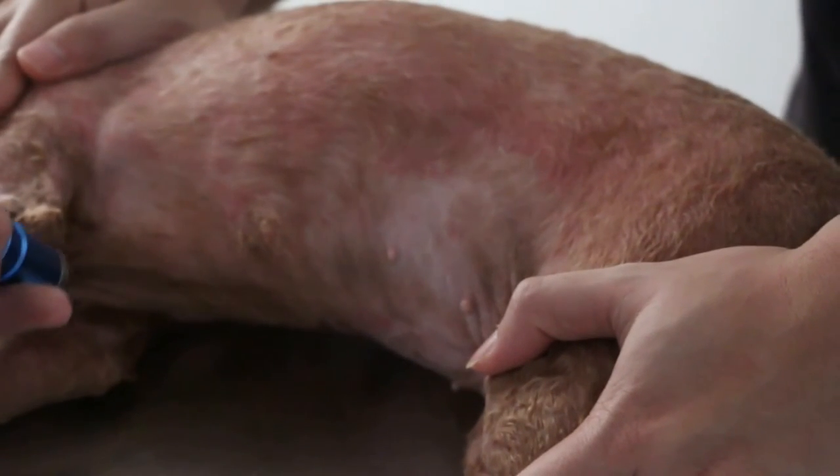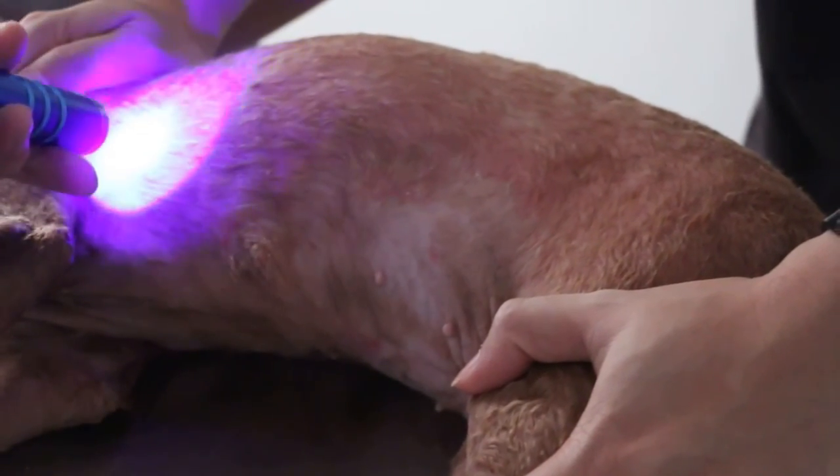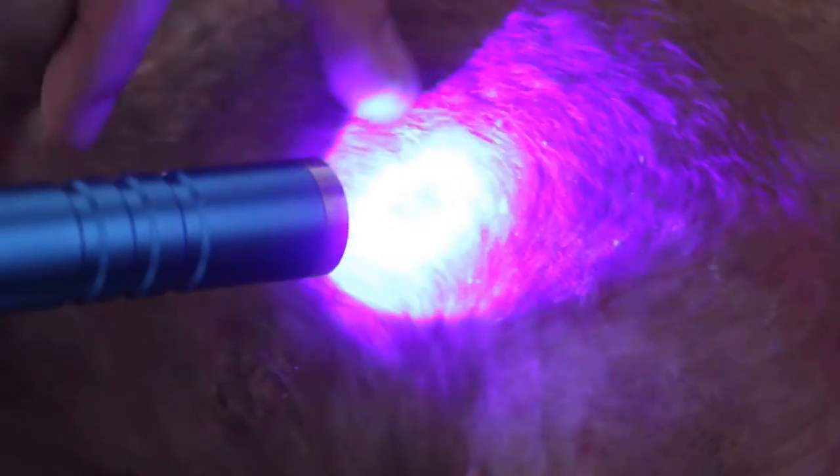December 20, 2014. I'm checking whether there is ringworm. It's fluorescent, so it's ringworm. They say all the fluorescent areas indicate ringworm. Only with ringworm does the area fluoresce like this, so there's more here.